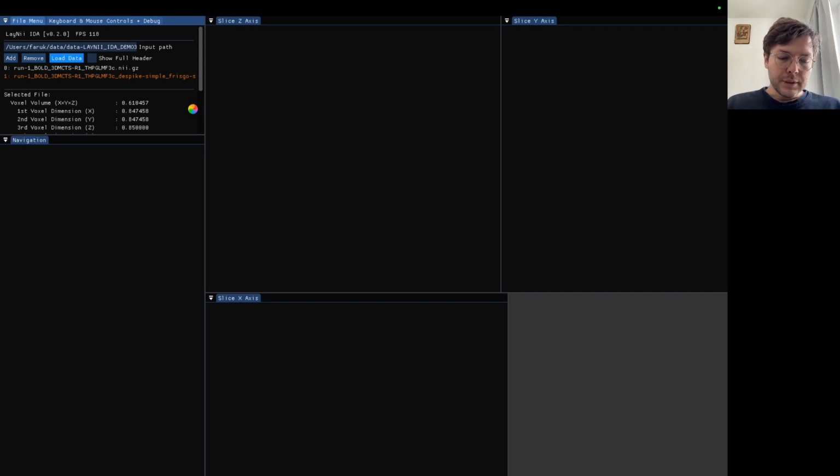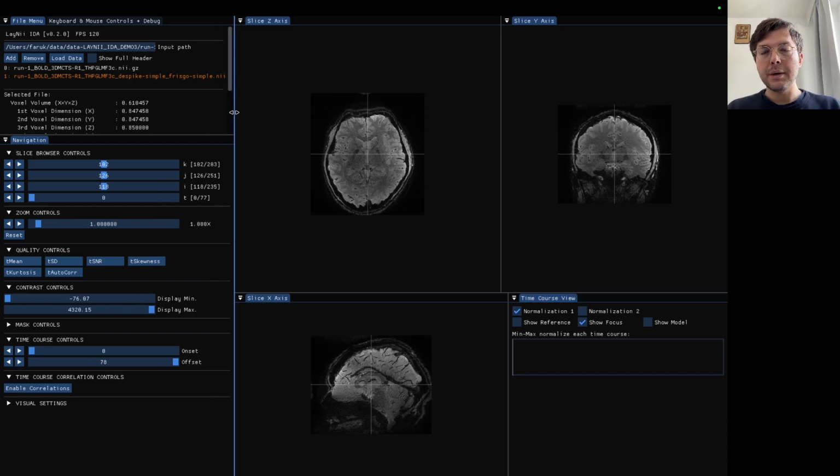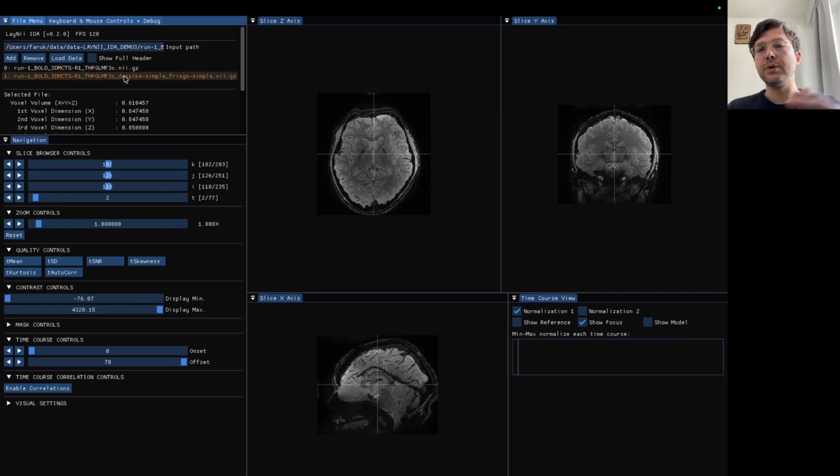And it is important that when you, of course, every time manipulate your data, you need to go back and check what has changed in your data based on the manipulation that you have done, maybe high pass filtering, maybe despiking. And for instance, let's see here. These are two of the same data sets, but the second one is processed a bit further.